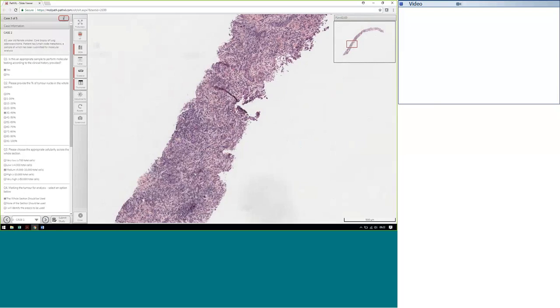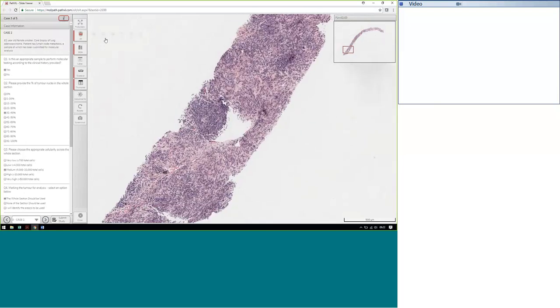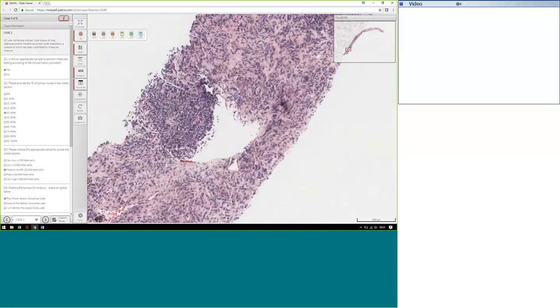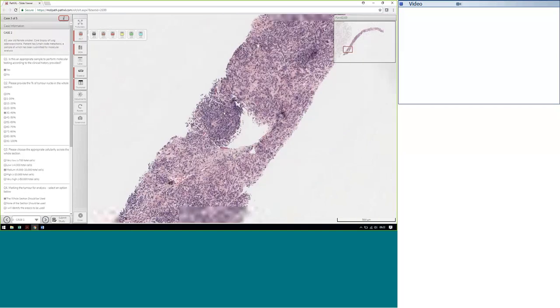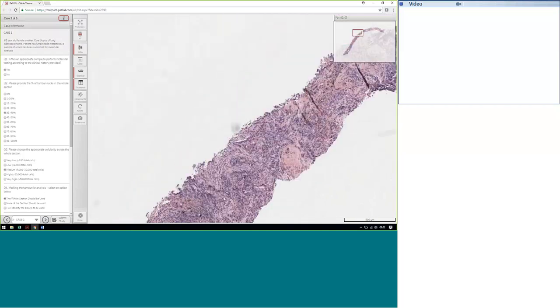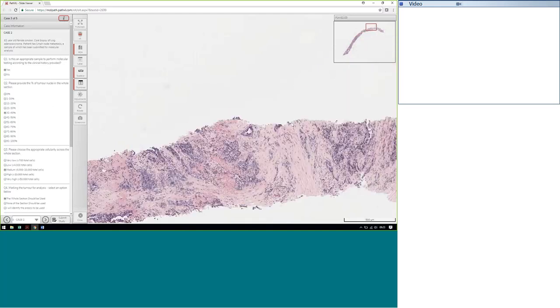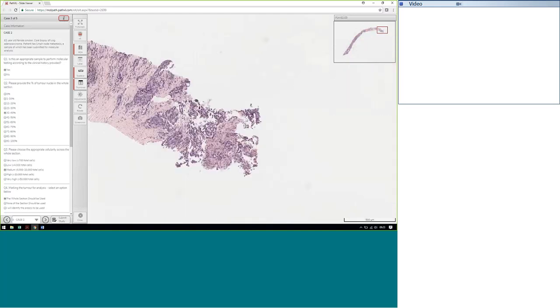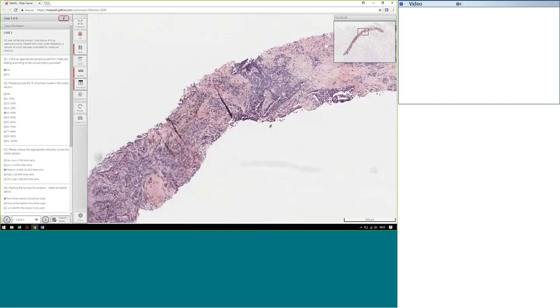However, the tumour is distributed well throughout. There are foci of lymphoid cells, which obviously are going to dilute the tumour DNA. So for annotation purposes, we would probably suggest that all of this could be submitted, even though there are areas.